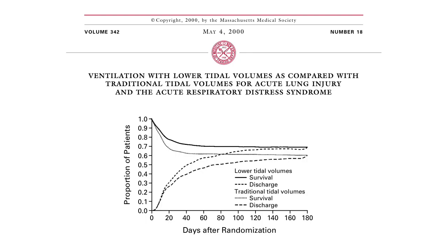For this reason, it's been shown that reducing tidal volume and ensuring that airway pressures are not excessive is actually associated with an improvement in mortality in patients with acute respiratory distress syndrome. So avoiding the risk of ventilator-induced lung injury can actually improve the patient's outcome substantially.